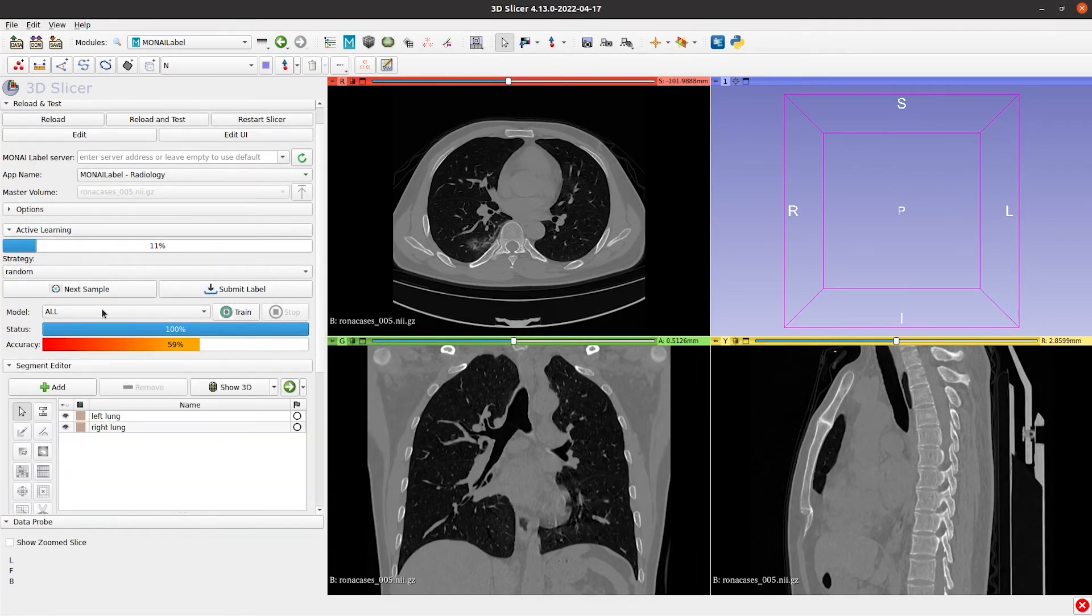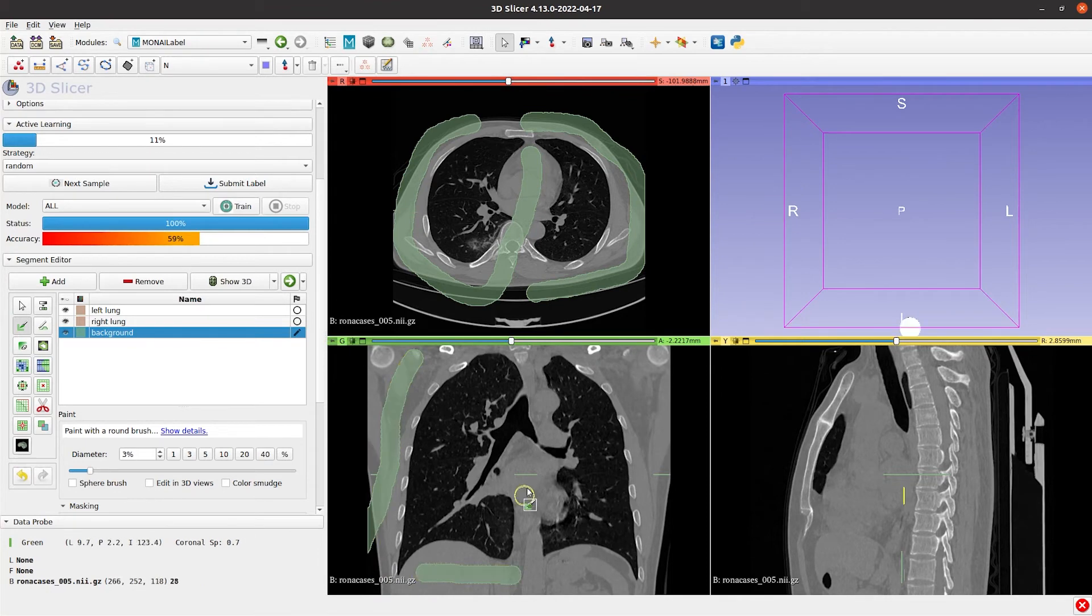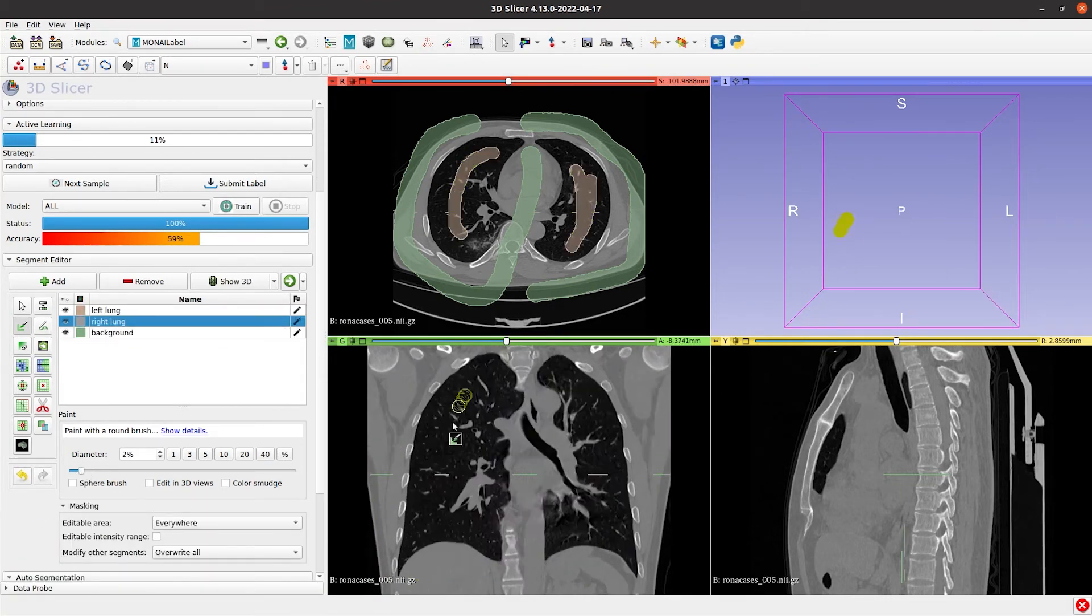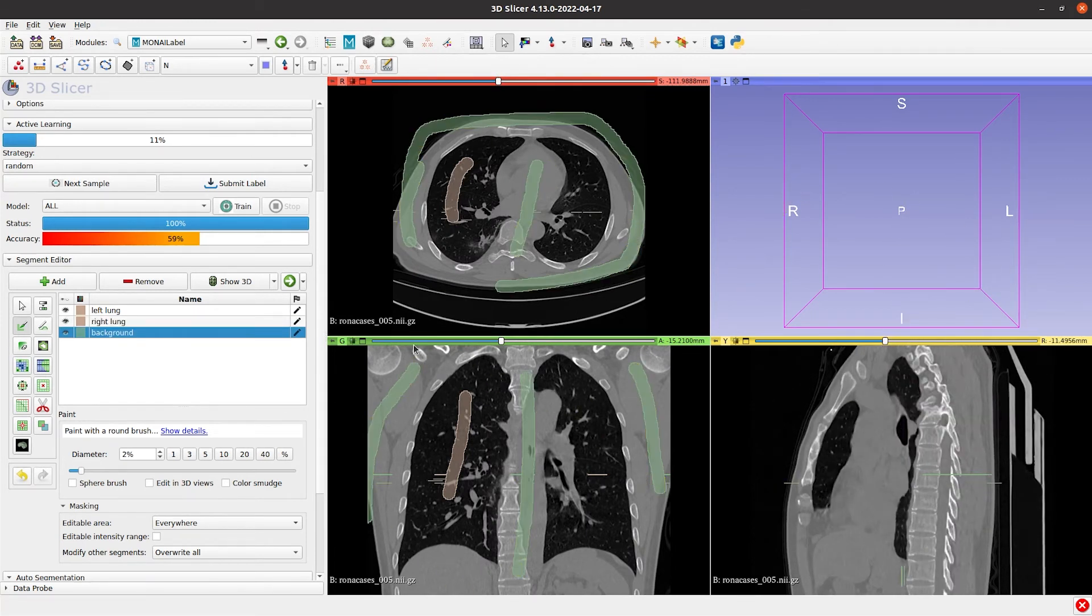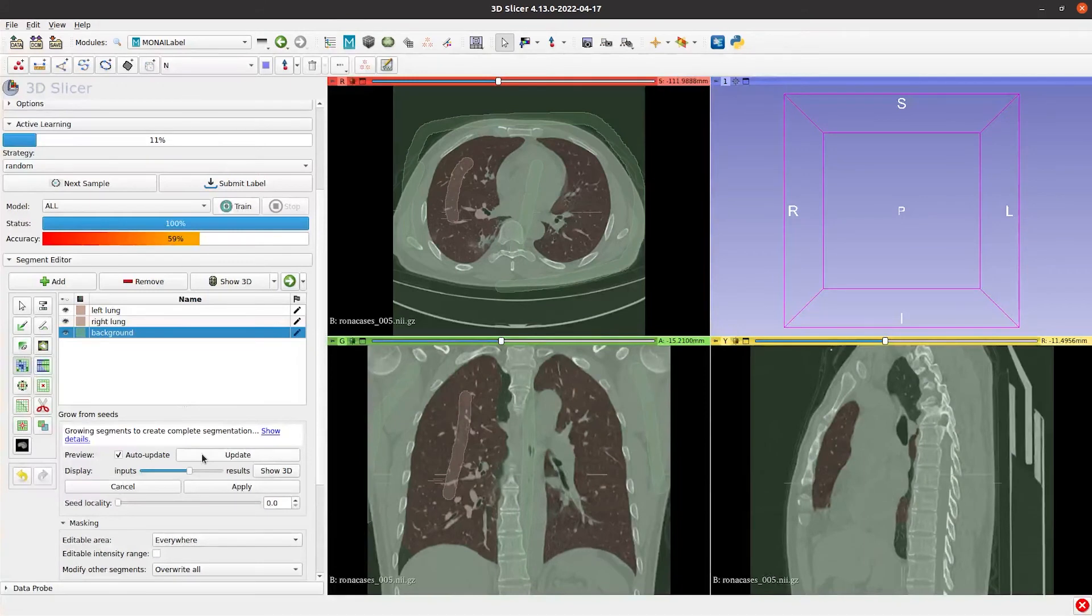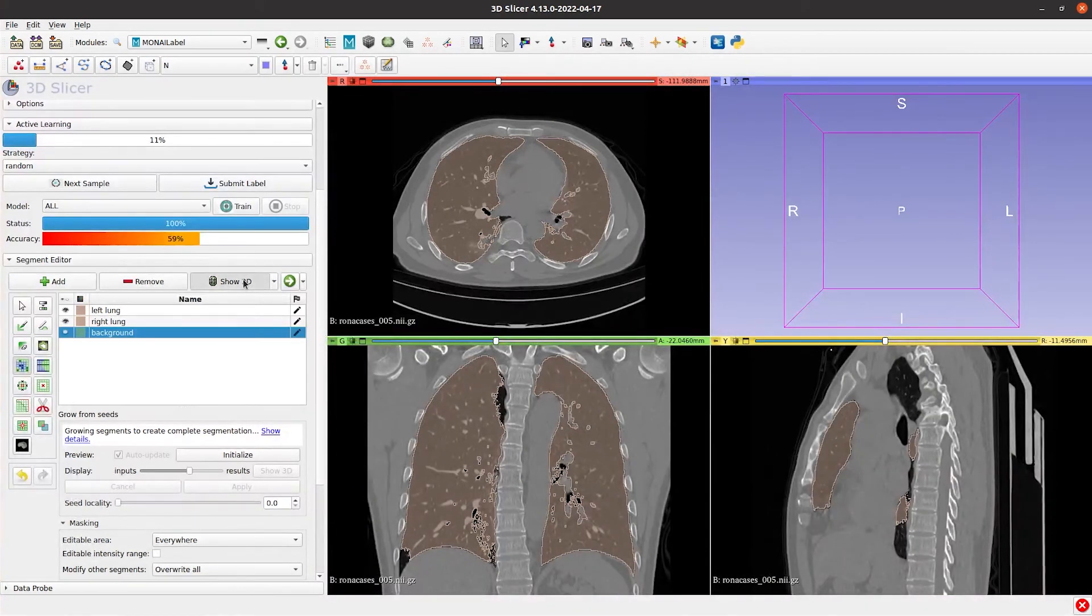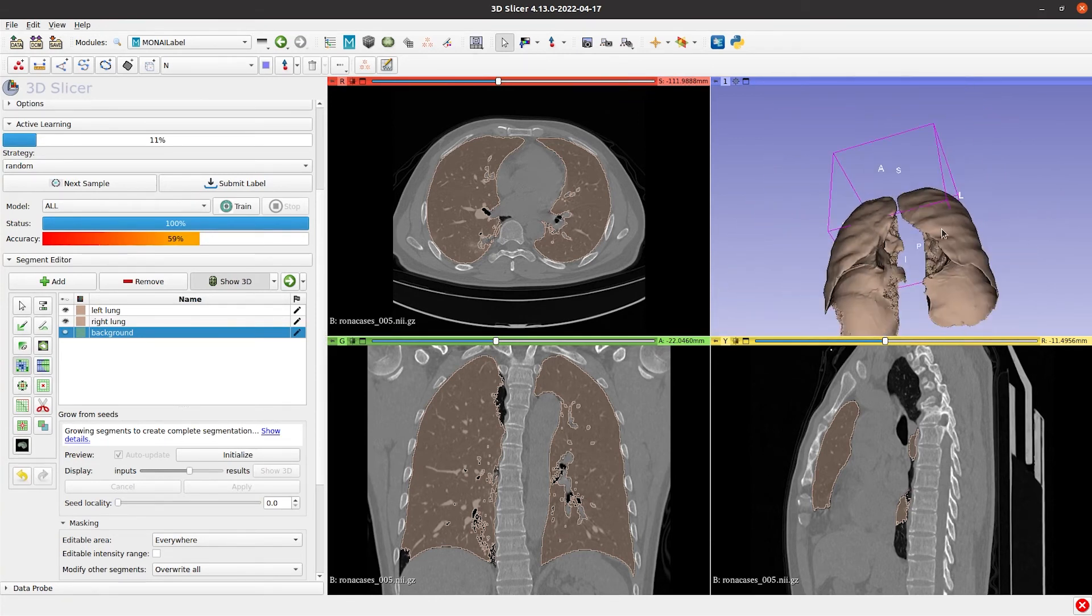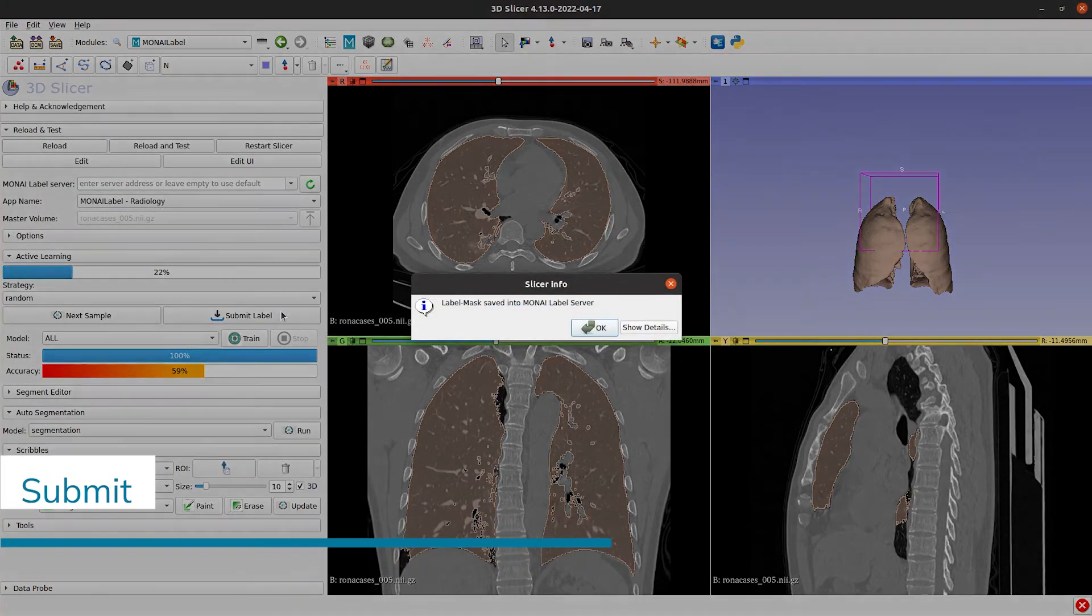We continue to create the background label, add Seeds for each segment, and initialize the Grow from Seeds functionality. Once the label is ready, we submit it to the server and start the training process again.